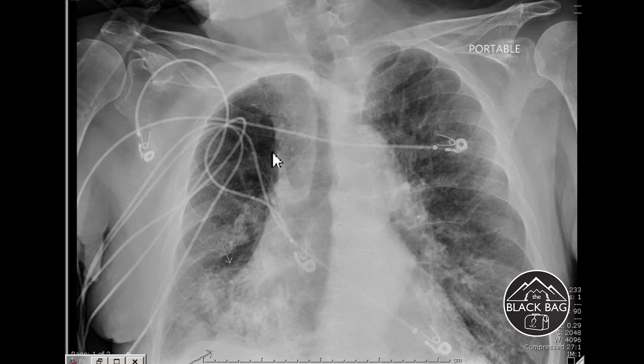Notice how wide the mediastinum is at the top. The stripe from the trachea over to the mediastinal shadow where the lung starts — the pleural stripe — is too wide. However, you can't count this as true mediastinal widening because the film is rotated. If this were a proper midline film with correct technique and you saw mediastinal widening, you'd start worrying about things happening in the mediastinum, such as bleeding or aortic dissections.